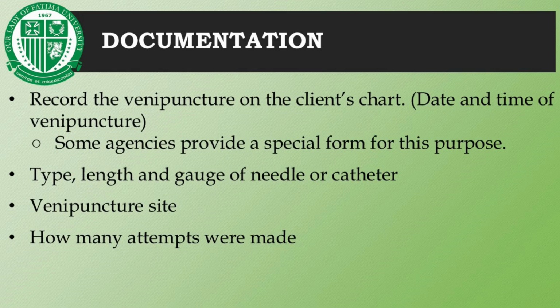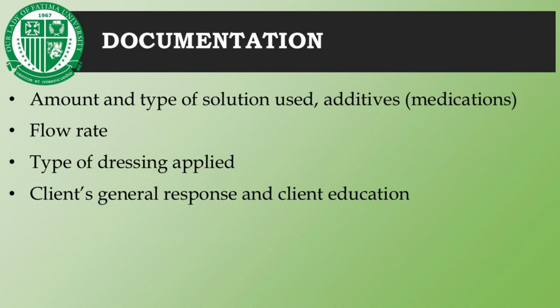We should also document the name or title of the person who performed the venipuncture. Do not forget to include the amount and type of solution used, and the additives or medications infused during IV therapy, also the flow rate, including the changes in infusion and its duration. Include the type of dressing applied for insertion site care, record the condition of the insertion site, and lastly, the client's general response and client education.